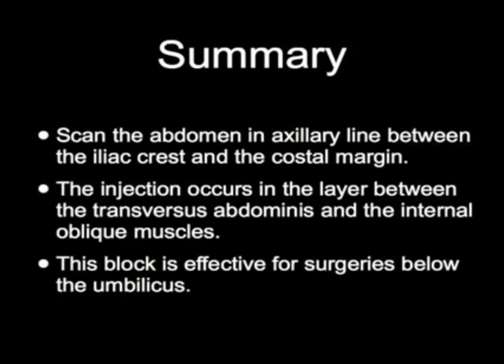Summary: scan the abdomen in the axillary line between the iliac crest and the costal margin. The injection occurs in the layer between the transversus abdominis and the internal oblique muscles. The block is effective for surgeries below the umbilicus.